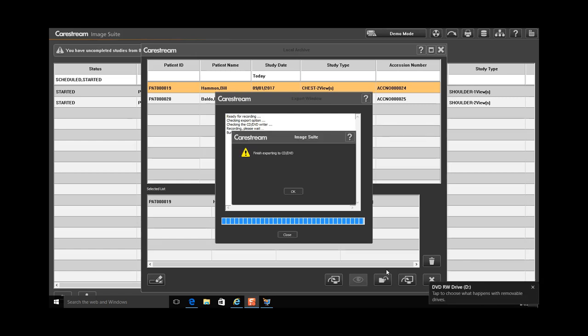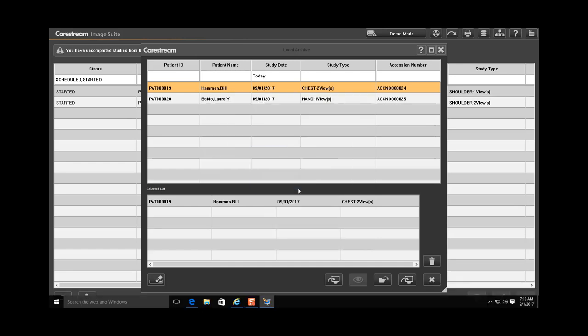Click OK. Your CD will automatically eject upon completion. Click Exit to close the Local Archive dialog box.